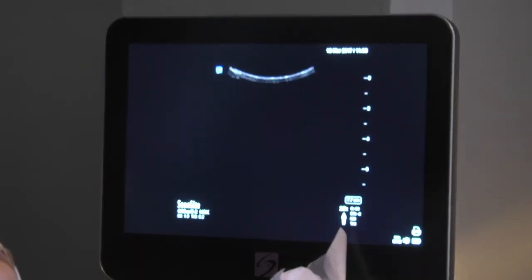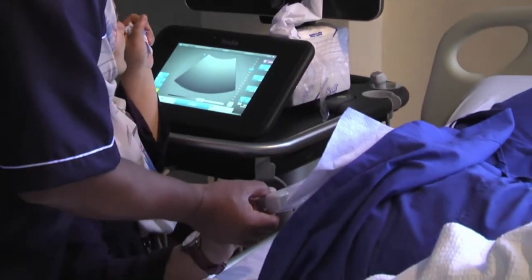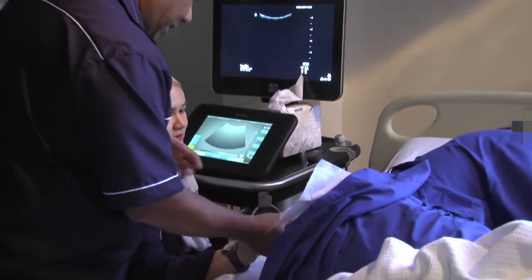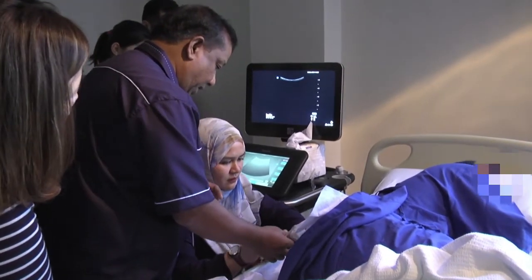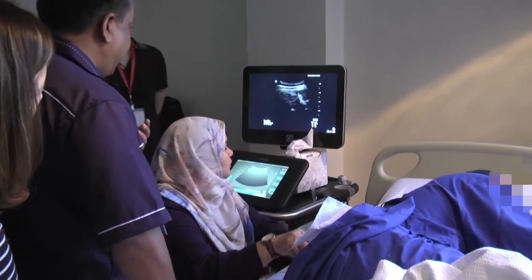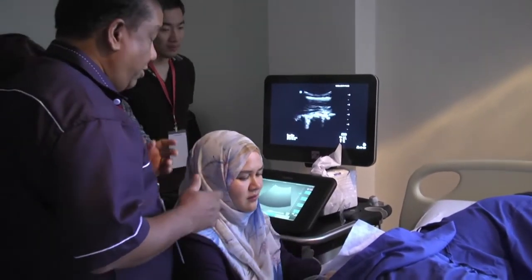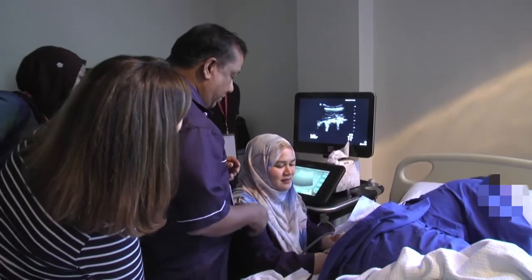As I mentioned before, it's better to do with how the orientation is. This is head, okay? Palpate the spine with your left hand and place the probe there. Train your left hand, train your non-dominant hand. Are you right-handed? I'm right-handed. So use your left hand, ma'am. Yeah, good.